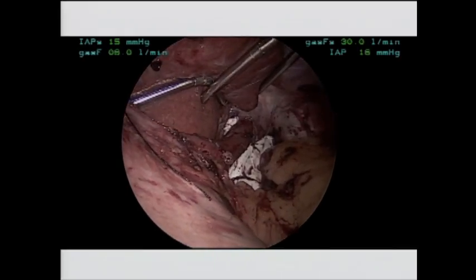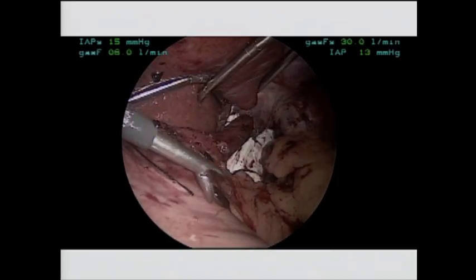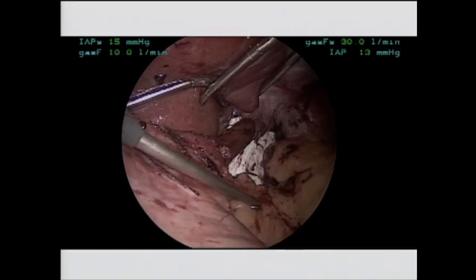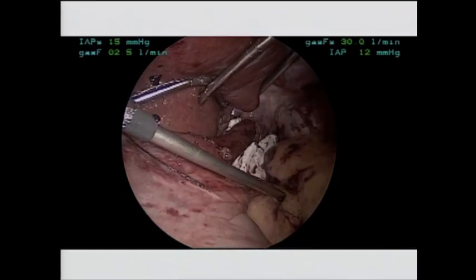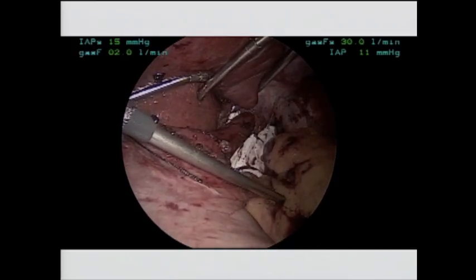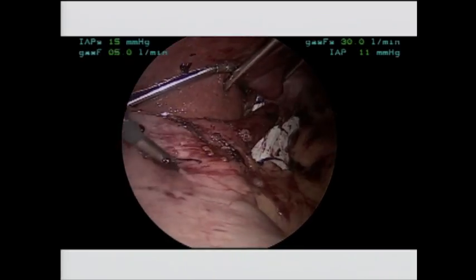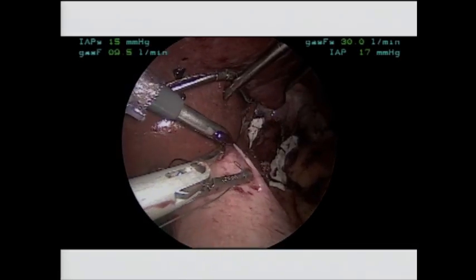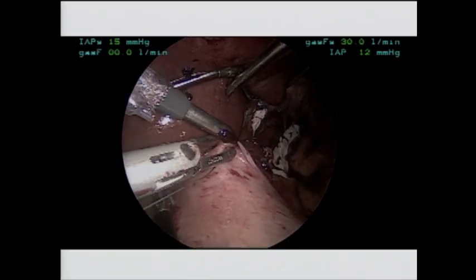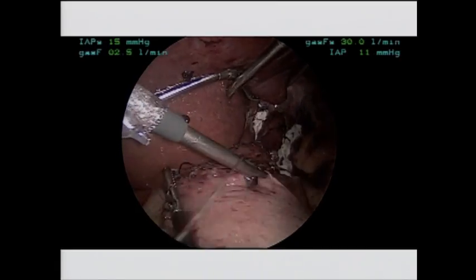Once you let go, if you pull a little more, it will move. So we always pull after we let go. And in this case, I'm going to give a gentle stretch. You just push over and watch where the end of the suture goes if you put a little back traction on it. And we're going to choose that point, and that point is going to be our traction point that we're going to use to represent the right-sided traction point or the posterior traction point in the fundoplication. We use the endo stitch. Just put a stitch there, tie it, and cut it long.